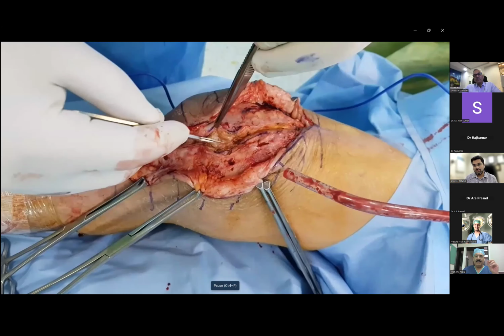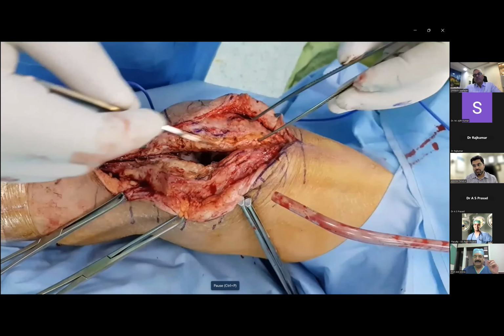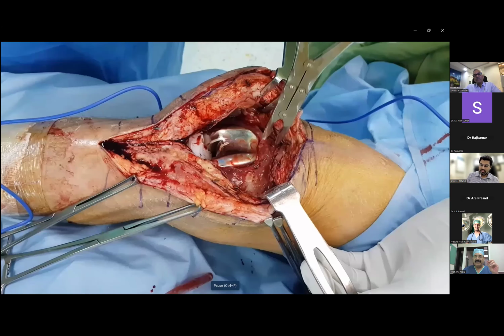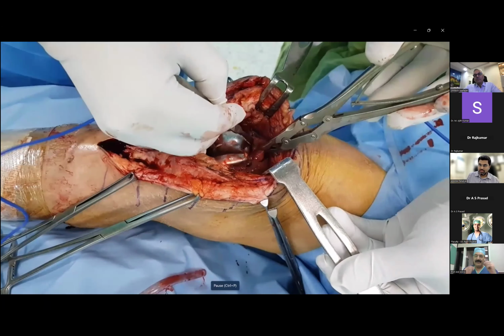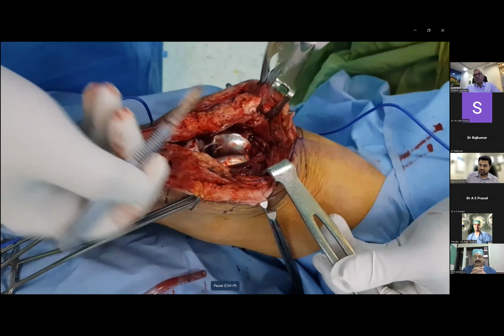And once you have opened up the knee, you start debriding the knee on either side to remove adhesions. We start from the suprapatellar area. This was an infected knee. We were taking samples. You take samples from various areas if it is an infected knee, and then gradually make gutters on the side: supromedial, supralateral, inframedial, infralateral.